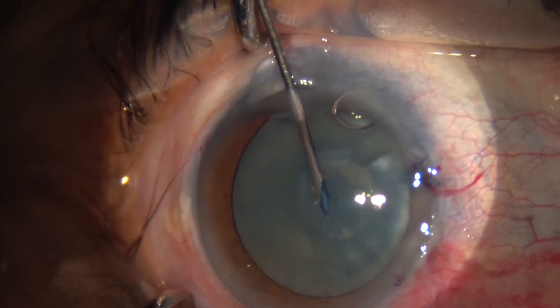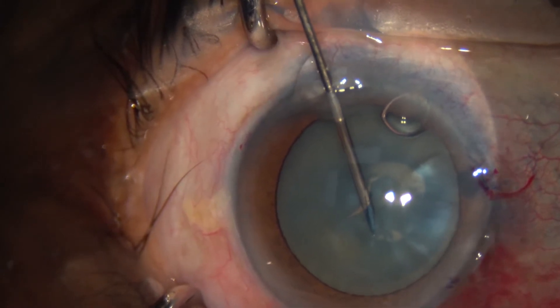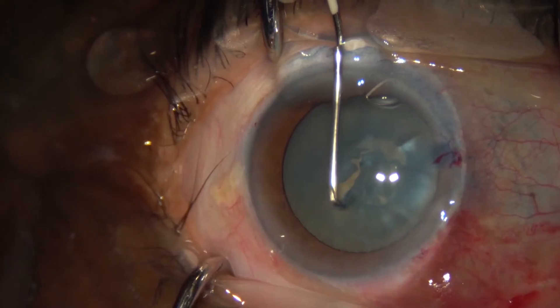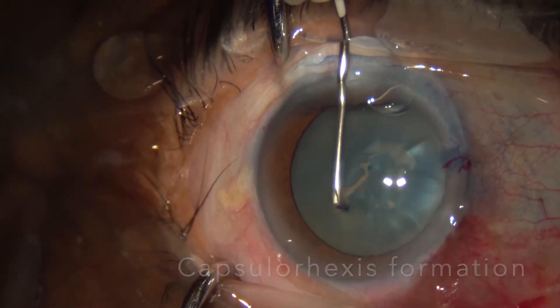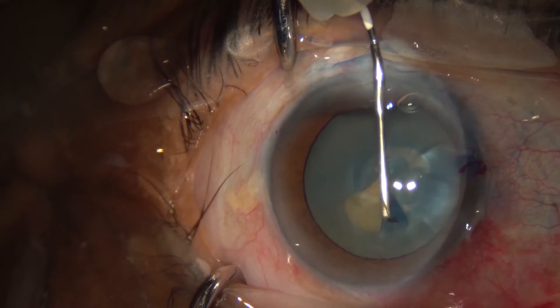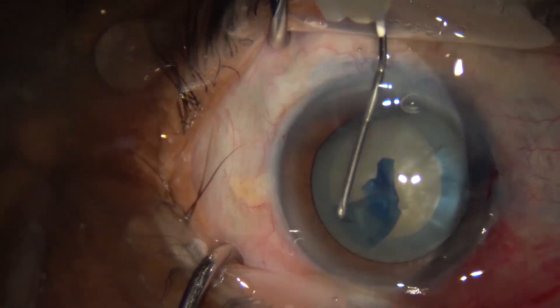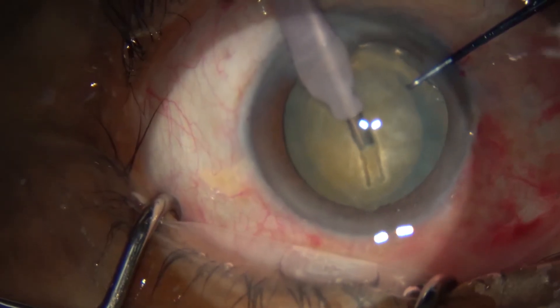Once decompression has occurred, we fashion a needle to create a continuous curvilinear capsulorhexis. The goal is to get the rhexis big enough but not so big that it risks running out — the ideal diameter is about 5.5 millimeters. The Vision Blue dye makes this much easier to see, and we use forceps at the end just to finish the rhexis off.